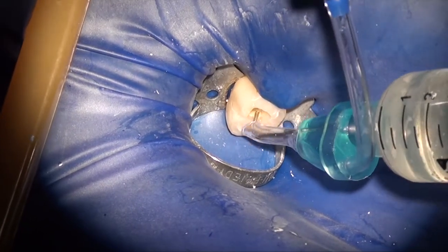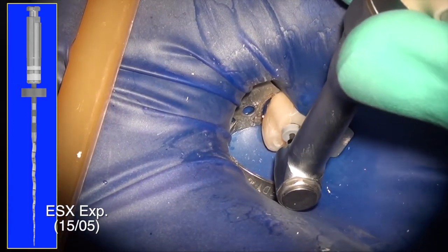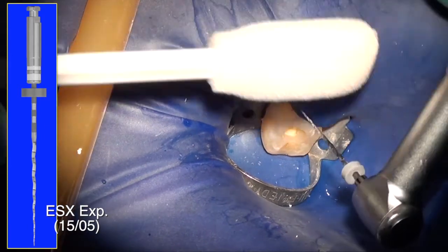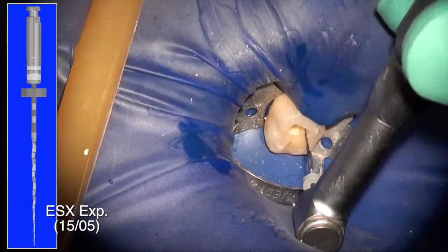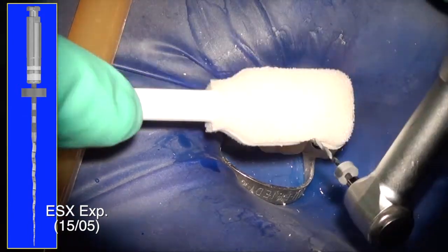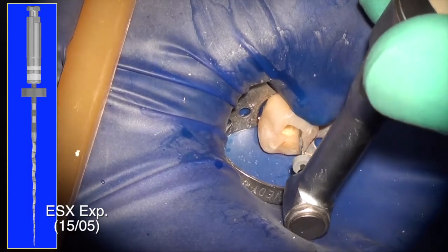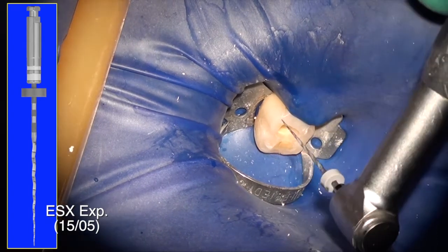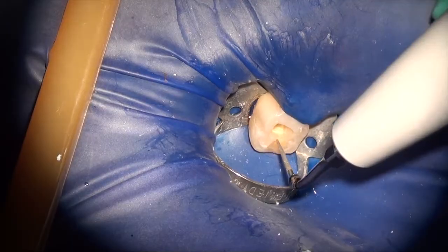Now the 1502 has reached the apex, and now it is time then to get the expediter down to the end. And I'm only taking the file down to the engagement. I'm not trying to press this hard to get down to the apex. It takes a few different strokes, and I'm going to be patient about it. After a few strokes on the mesiobuccal, I reach the apex, and on the mesiolingual as well, I've reached the apex too. So I now have the expediter shape.